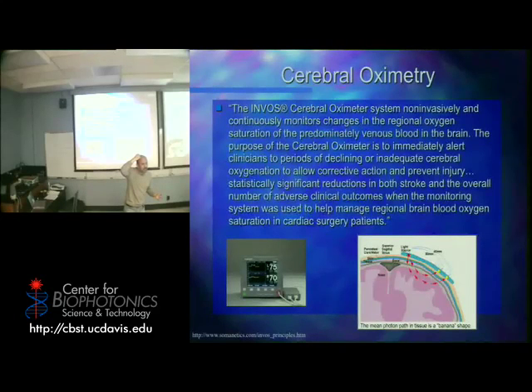Red and near infrared. That's what we use for pulse oximetry. They can pass it through your brain and effectively tell whether in that portion of your brain there's fresh blood. And the reason we care about that is because, you guys ever heard of MRI? And how about fMRI, functional magnetic resonance imaging? Okay, so MRI, you guys have seen all those pictures. They give you slices of the structures in your brain.